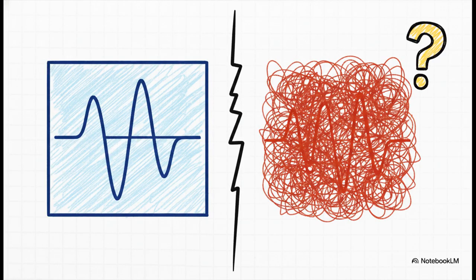But here is where our story takes a pretty surprising turn. We have this incredibly elegant, logically sound pulse sequence that produces a clear, maximum signal proton density weighted image. It sounds perfect. Yet, if you walk into a modern hospital today and observe an MRI scan, you will practically never see the true saturation recovery sequence being used in clinical practice. It is, for all intents and purposes, completely obsolete. So we kind of have to ask ourselves, why? If it works so perfectly in theory, what actually breaks down in reality?